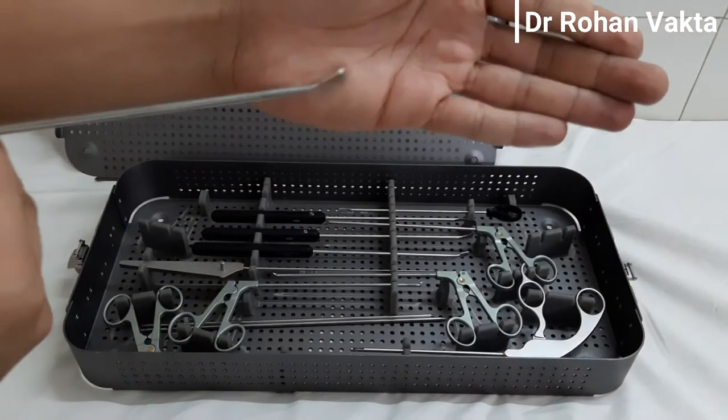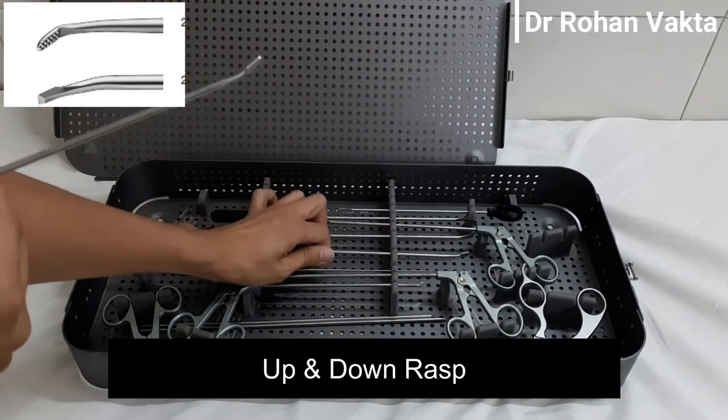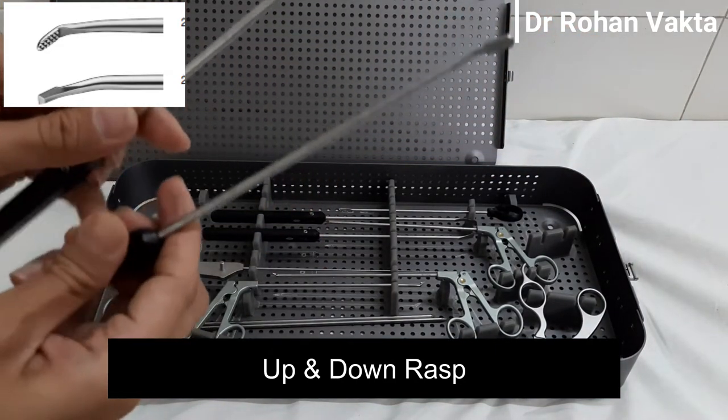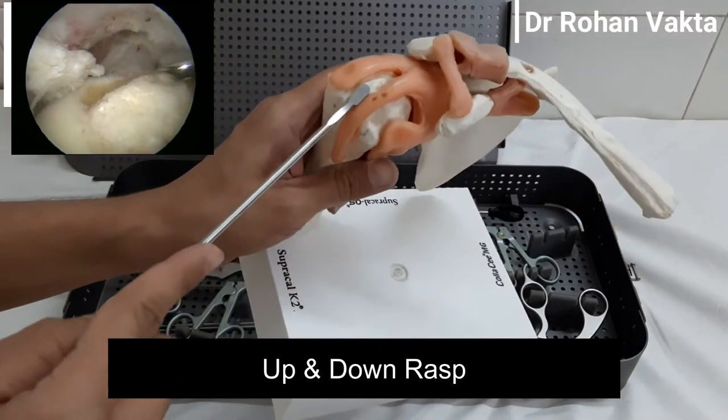This is the rasp. It has a serrated tip. There are two rasps — upward rasp and downward rasp. Both of them are used to create a bleeding bony bed for better healing of the soft tissue.